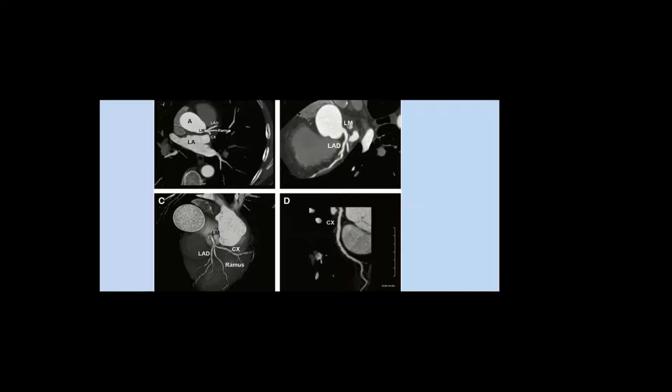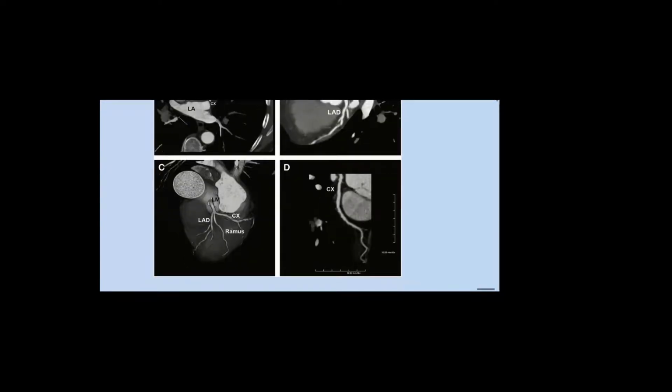Okay, as C, this volume rendered or 3D is great for what? Yes, volume rendering. It's great for what? It's great as a roadmap. It's a very impressive, pleasant picture. You can append it in the report, even the patient can read. It's so pleasant, but it's not used for vessel analysis whatsoever.